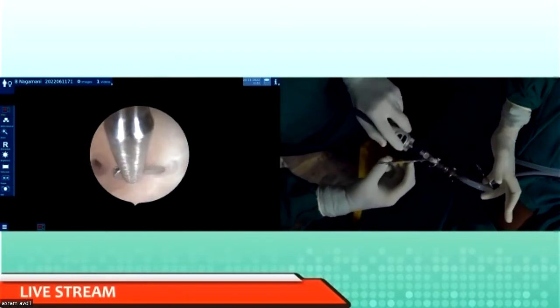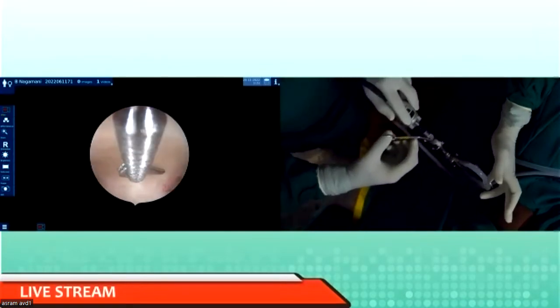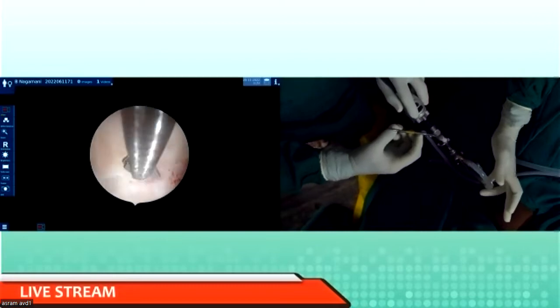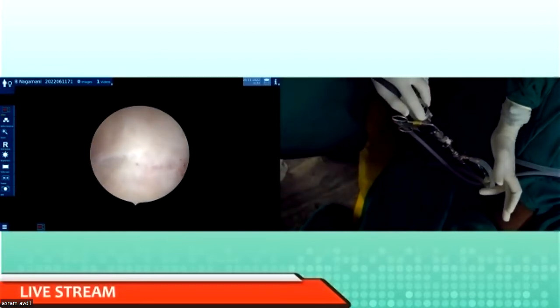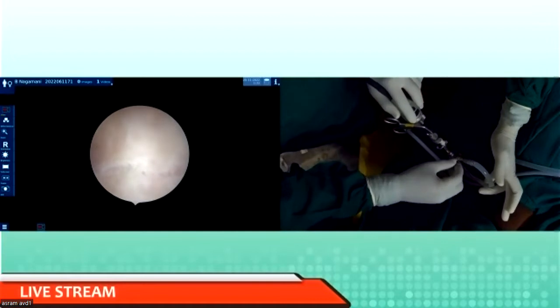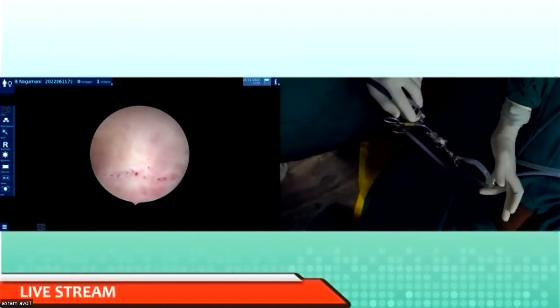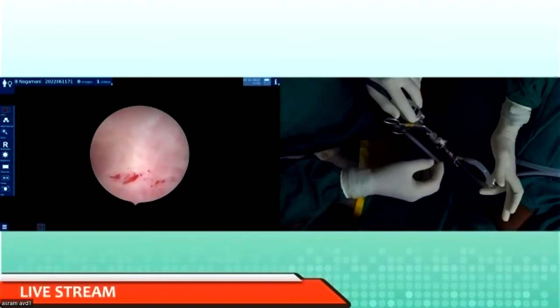Okay, sir. We wanted to see the septal resection. Our patient did not have one, so I'm just showing you like that. The most important thing is, look at that, the white is becoming pink. Yes, sir. That means you're going into the myometrium. If you cut further, it will start bleeding. So that is the limit where you have to stop.